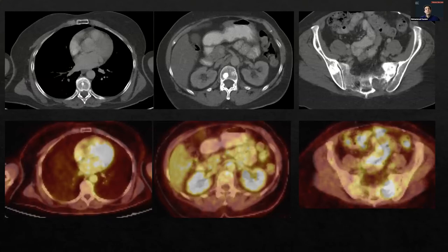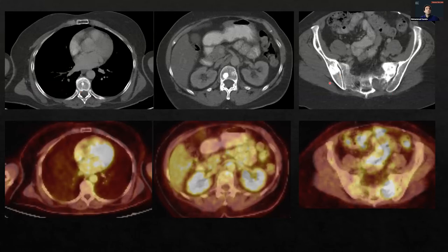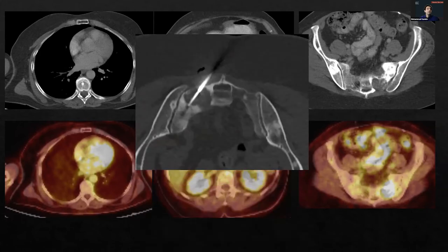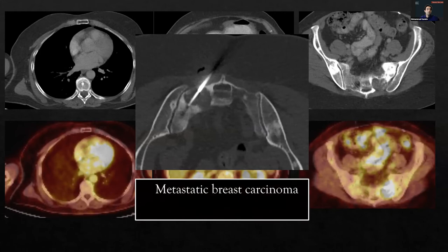Here's an example: a patient with breast cancer diagnosed in 1997, who had bilateral mastectomy and subsequent hormonal therapy, recently presenting with new back pain. There are multiple mixed sclerotic and lytic lesions. On PET CT, majority of those sclerotic lesions have no FDG avidity — these are probably treated metastatic disease that, if targeted, probably won't answer your questions. We decided to go after a more lytic lesion involving the left side of the sacrum, which was FDG avid, and the biopsy came back positive for recurrent metastatic breast carcinoma.